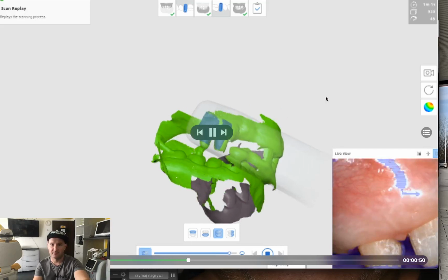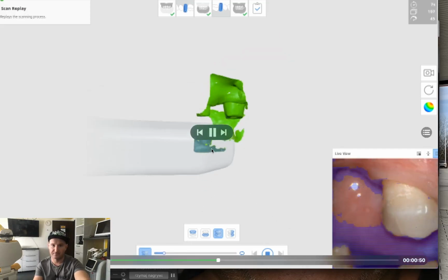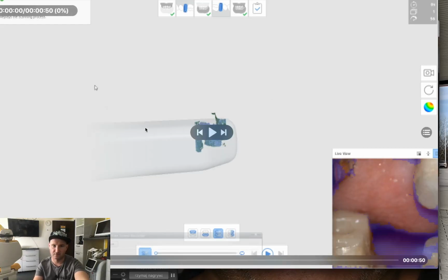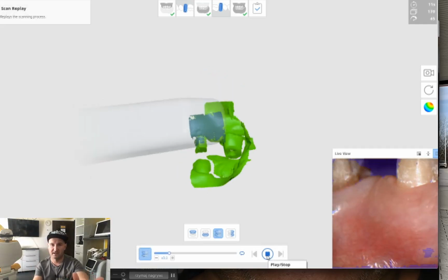So the best option is, when you go with scanning, let's say your right occlusion, just go as shown here on the video, just see it again, just go from the right side to the left side.